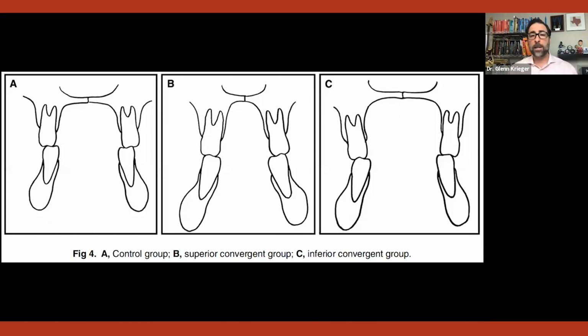And if you look at the palatal width as another example, it tends to tell you that the maxilla is narrow, and it's narrower, the width, than the mandible. So looking at the inclination of those lower teeth, what makes up the curve of Wilson, Monson sphere, however you want to refer to it, when those lower teeth are tipped in considerably and we upright them, we're going to put these people into crossbite. And that's a skeletal issue, not a dental issue.